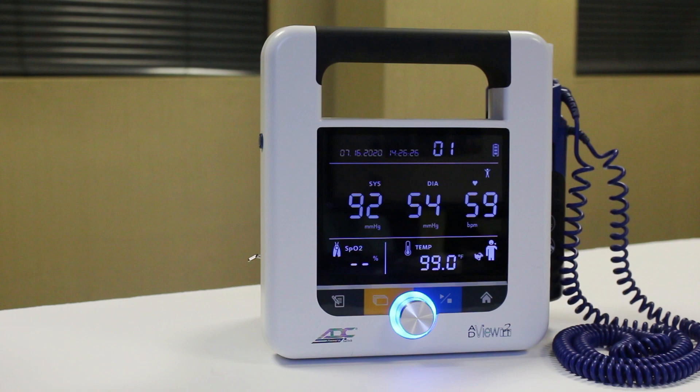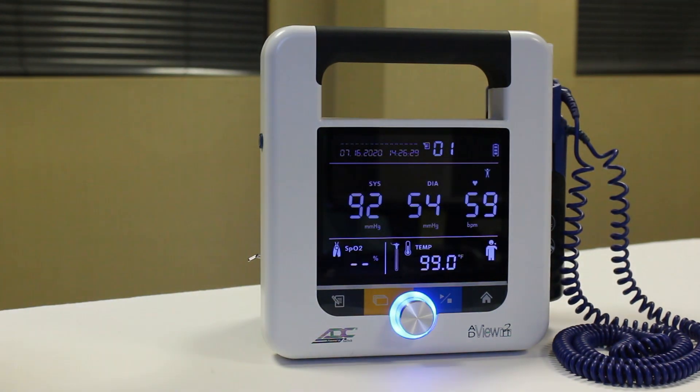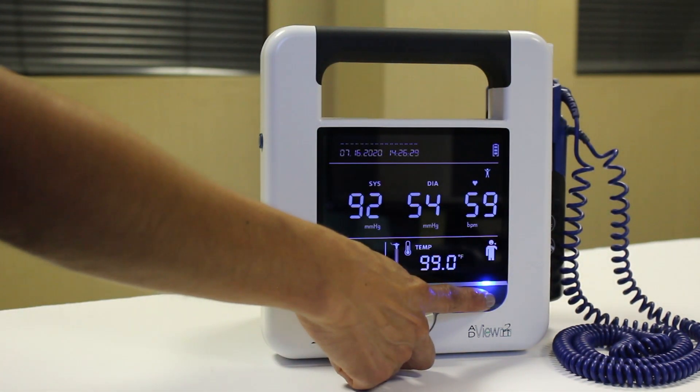Before starting, ensure any previous values are cleared from the display. Press the memory button to save an earlier reading that's still on screen, or press the home button to clear an older reading without saving it.